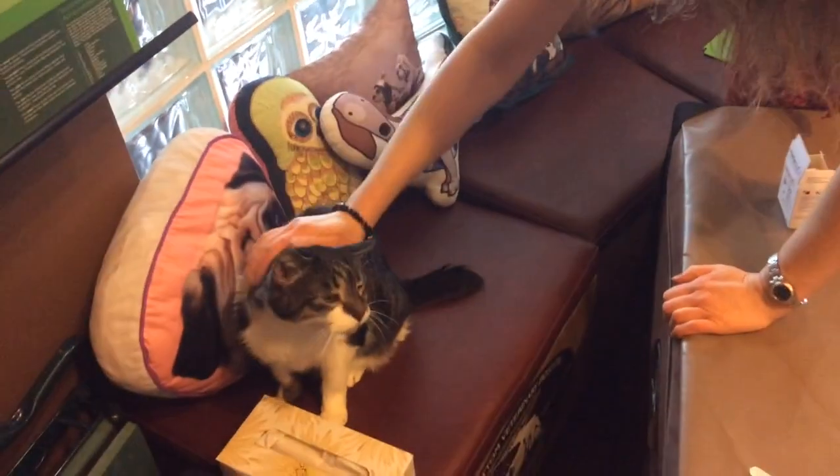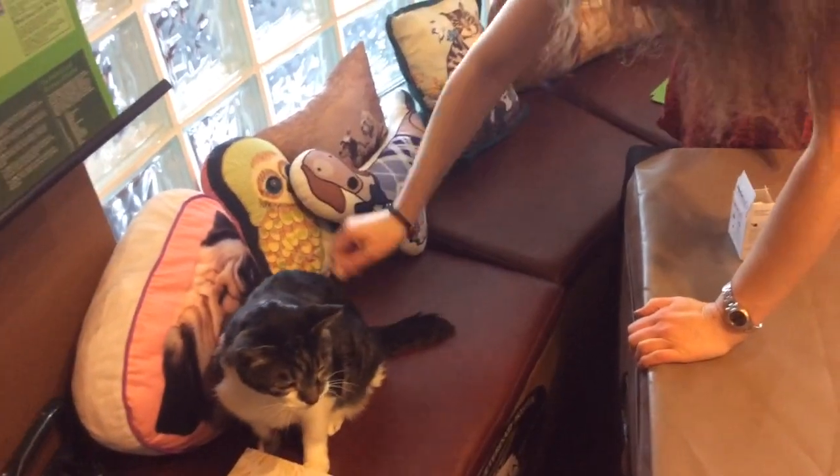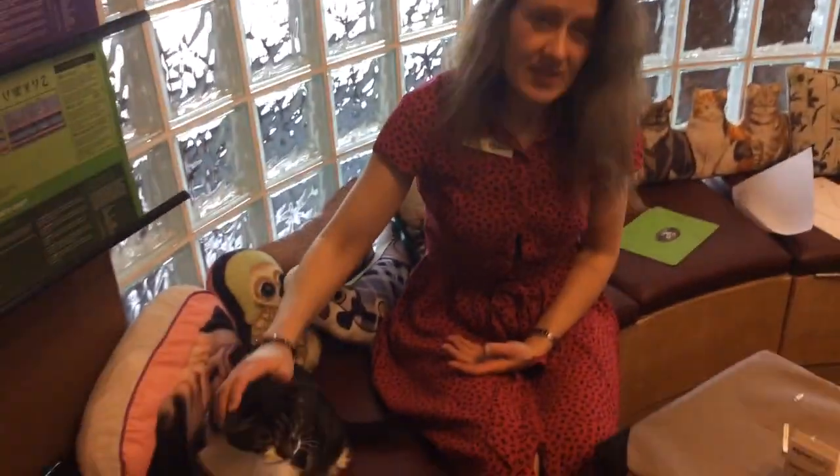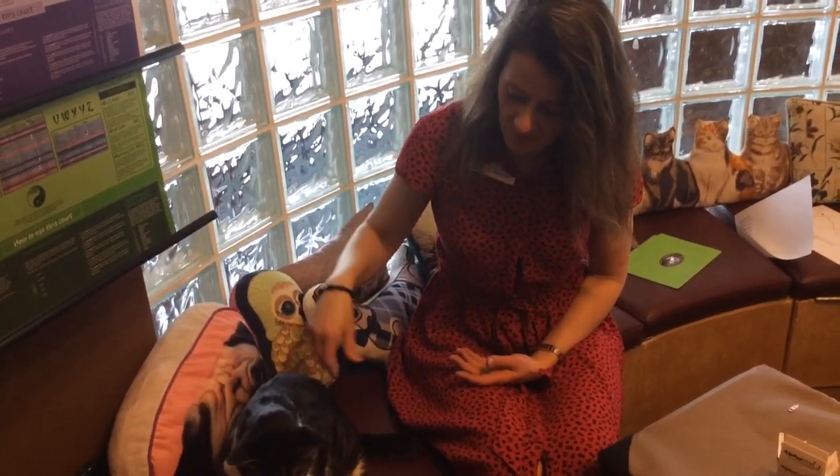After the procedure, I always pet the cat to reward him and let him know he's a good boy. I never like to do a procedure without rewarding the cat with some love, just to let him know you're not always going to be pricking his ear every single moment.